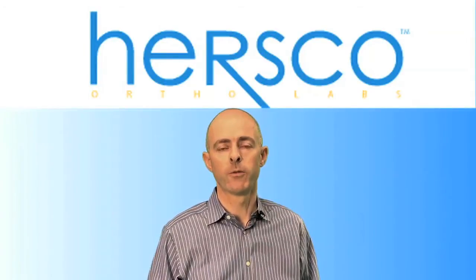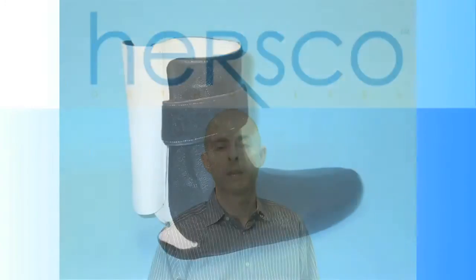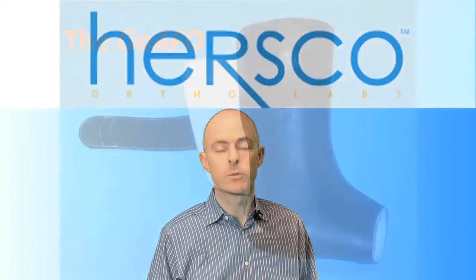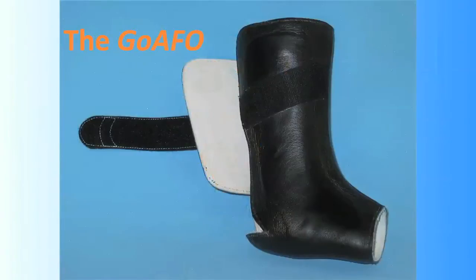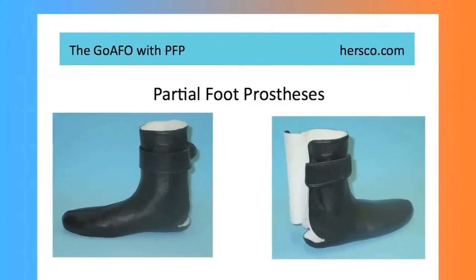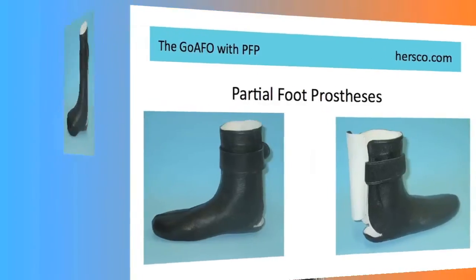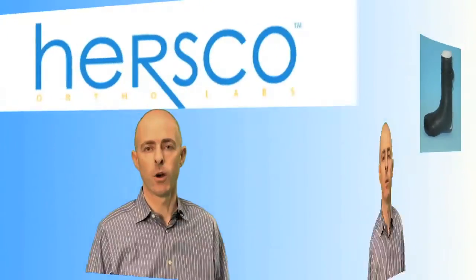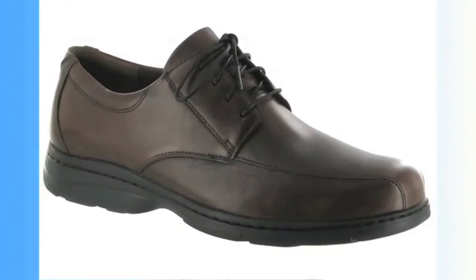In other cases, where a patient is not willing to wear an AFO or it's not suitable for them, it's possible to make a plastic and leather type ankle gauntlet. One design that we found very helpful in these cases is to use what we term a go AFO, which is a rear entry ankle gauntlet. This makes it easy for the patient to don the device. The residuum is protected inside the actual gauntlet itself, and then a toe filler portion is extended, but it's now an integral part of the device, so the patient needs to only wear the ankle gauntlet and they can slip it inside a regular retail orthopedic shoe.